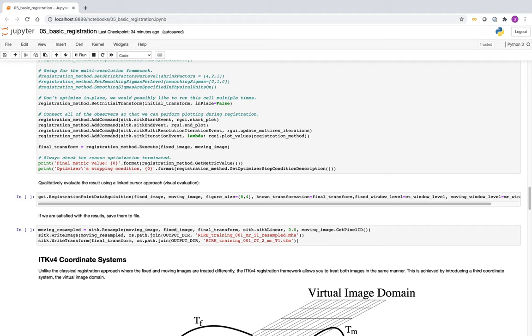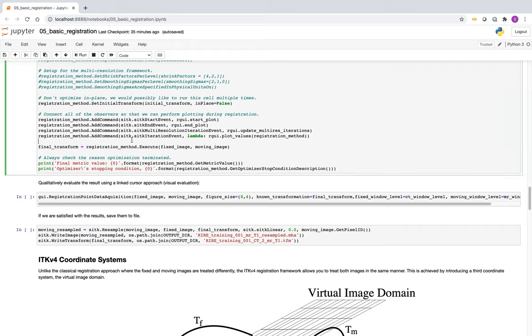We add commands using the command observer pattern. When an event happens during the registration process it calls these functions — for start, end, multi-resolution changes, and iterations. We plot the similarity metric as iterations proceed, then execute and always print the final metric value and the optimizer stopping condition. You want to know why registration terminated — it might be early termination, and that's not good.